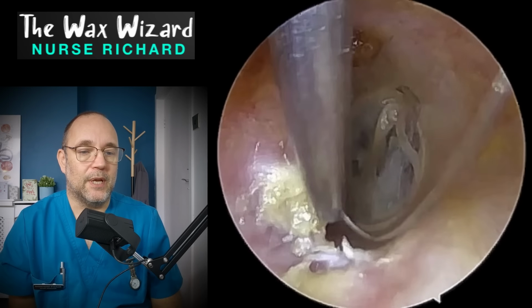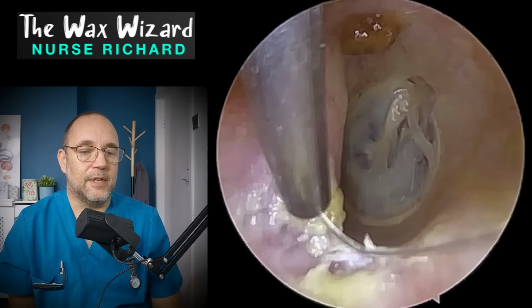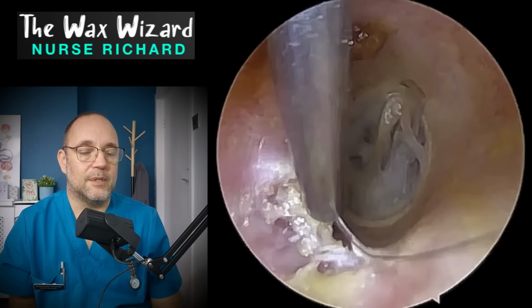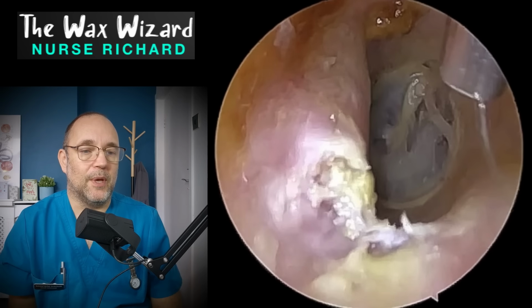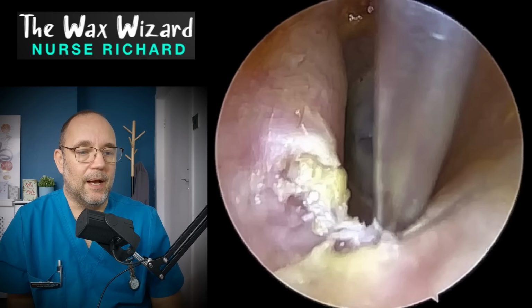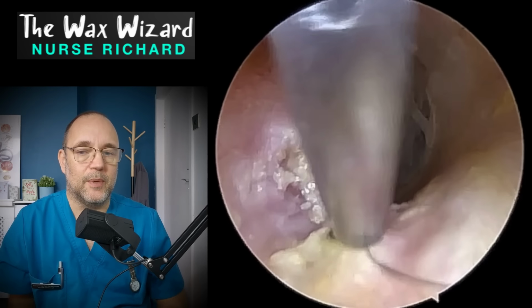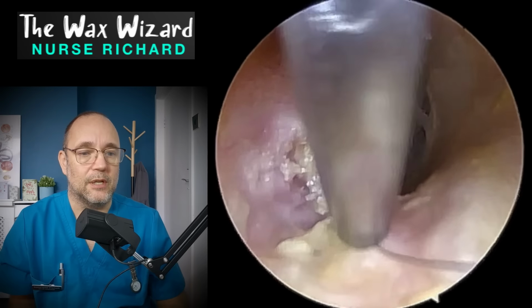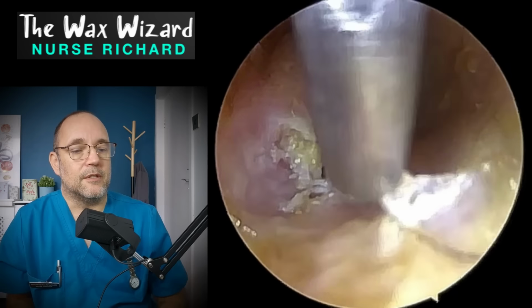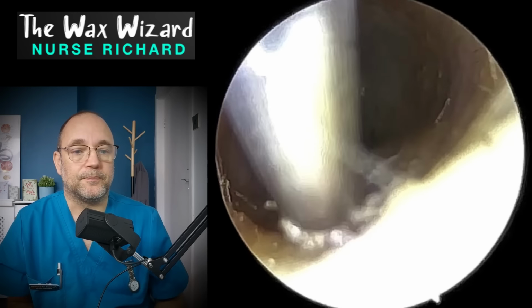So I'm just trying to touch up against that to see if any of it comes away, to reveal exactly what's going on behind there. And yeah, a little bit of it does, but I do suspect there's something going on behind there that needs looking into relatively urgently. As to what the cause of it is, I don't think you can ever 100% know. Like I said, this lady had some health conditions. She had a chronic lung condition. She also had a heart condition. She didn't have diabetes. And all those things can affect the blood flow and the circulation in your body.